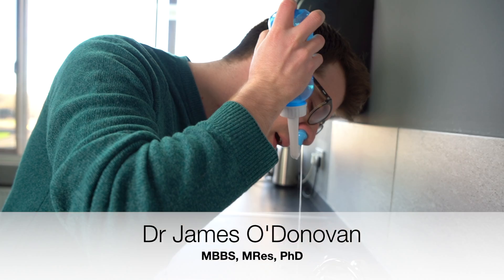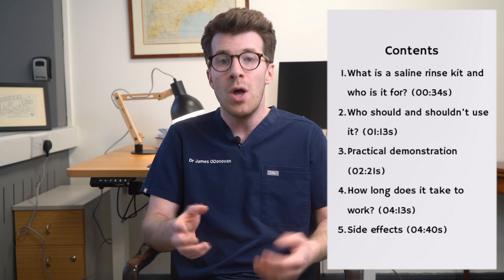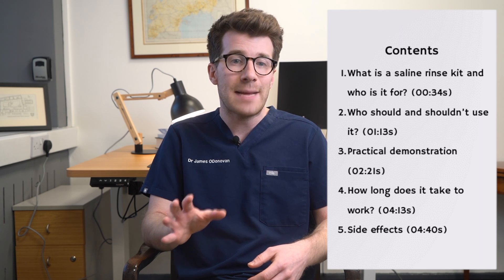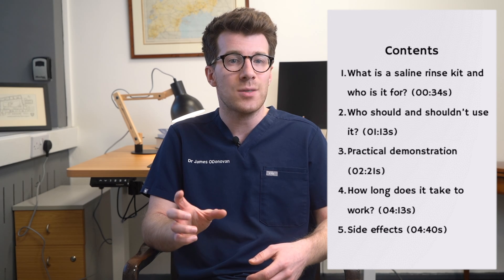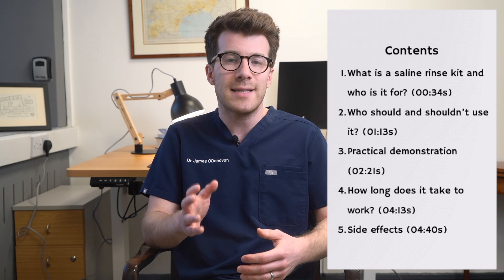In this video you're going to learn how to use a nasal saline rinse kit. We'll also cover what a nasal irrigation set is and what you can use it for, reasons you can as well as shouldn't do it, a practical step-by-step demonstration where I demonstrate this on myself, plus where you can purchase the kit, how long it takes to work, and finally we'll cover possible side effects of conducting nasal irrigation.